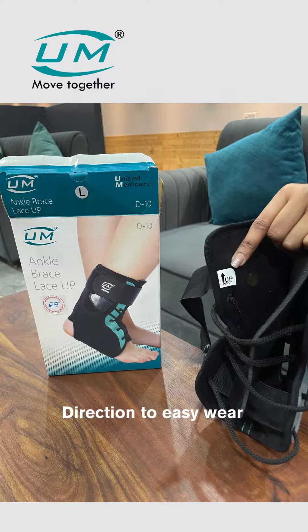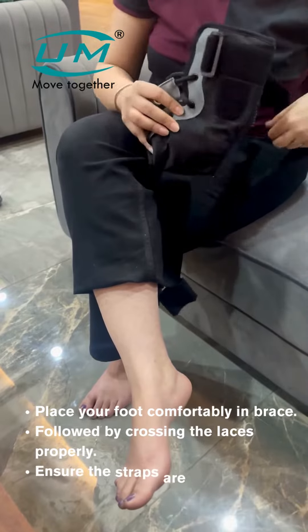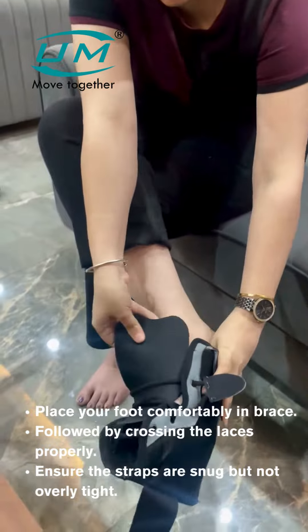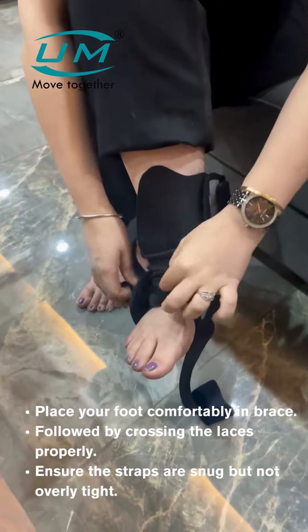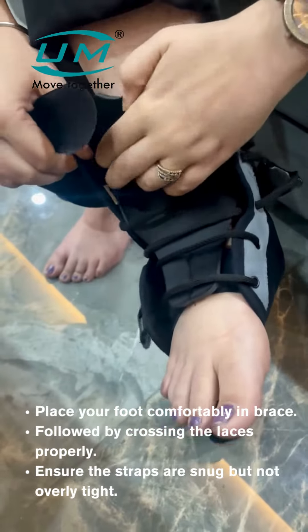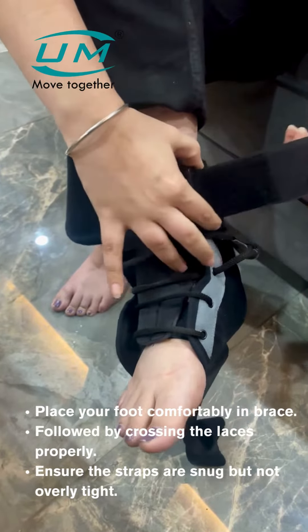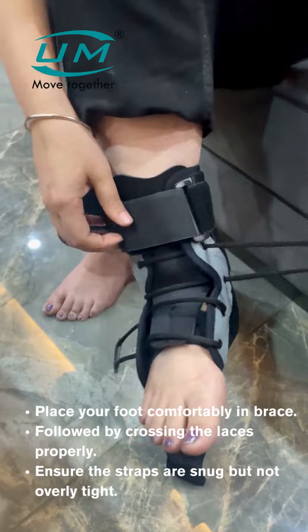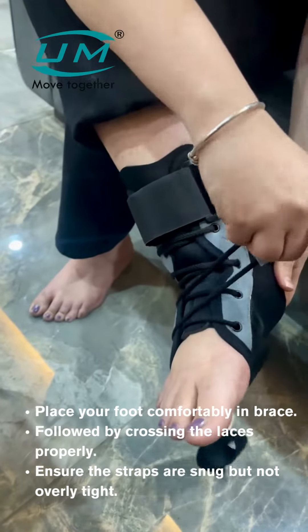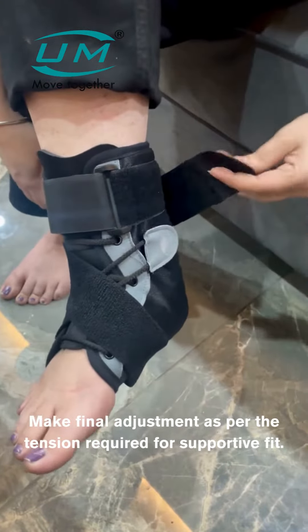To wear the brace, place your foot comfortably in the brace, then cross the laces properly. Ensure the straps are snug but not overly tight, and make final adjustments for the tension required for a supportive fit.